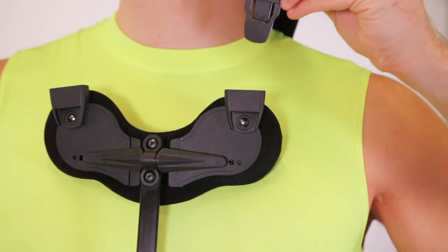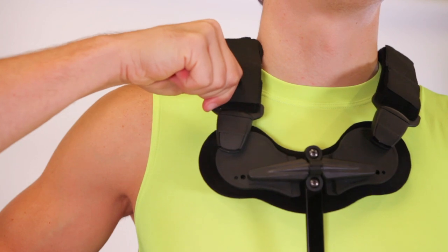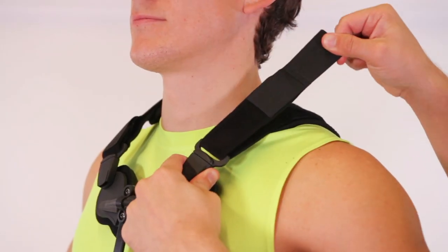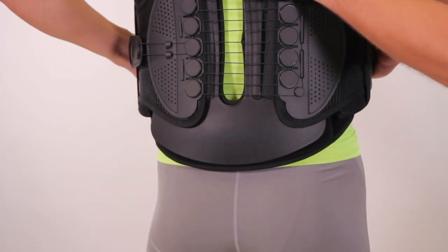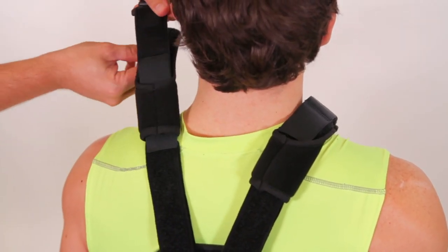Attach the shoulder straps from the back panel to the sternum attachment. Adjust the shoulder straps so the back panel bottom is at the beltline. Adjust the soft shoulder padding so it sits on top of the shoulders.